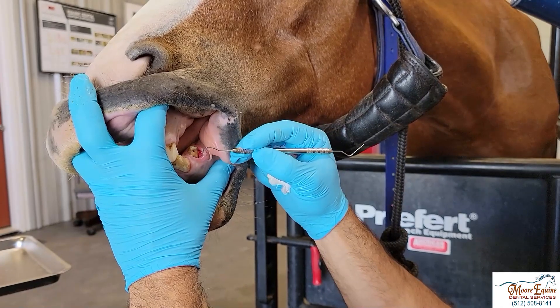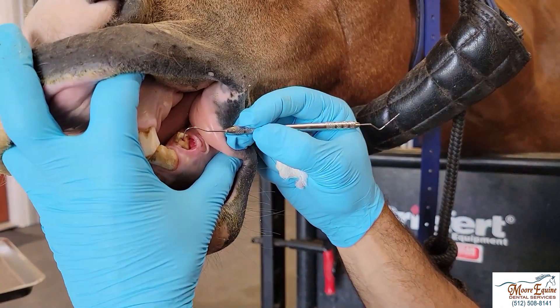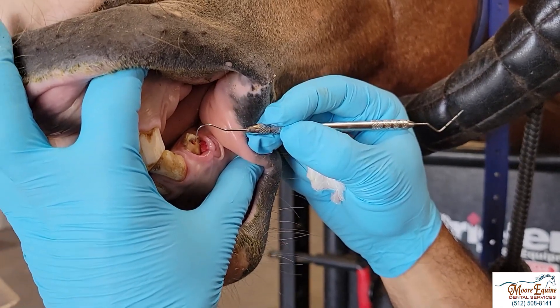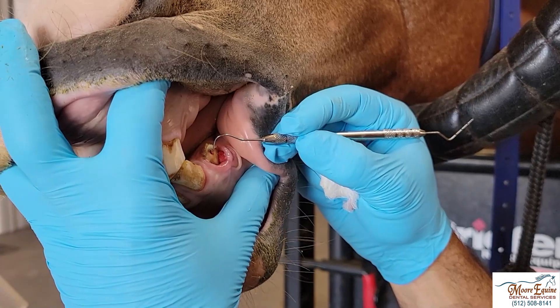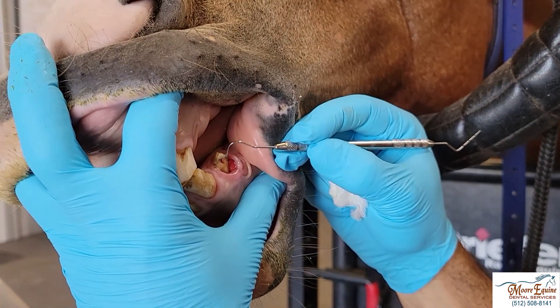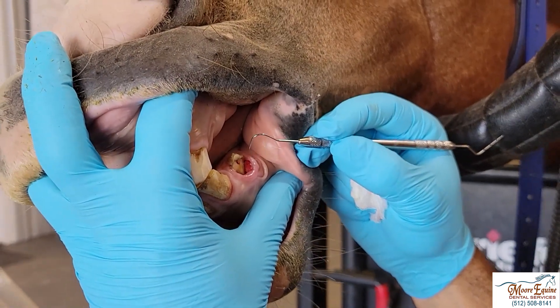Here we can see how he injured this canine tooth. If we look closely and I probe right here, I can see that the pulp is still alive — it's still bleeding. Because the pulp is still alive, we can actually burn that out, do a pulp capping, and save this tooth. We'll also remove a little bit of this granulation tissue here.